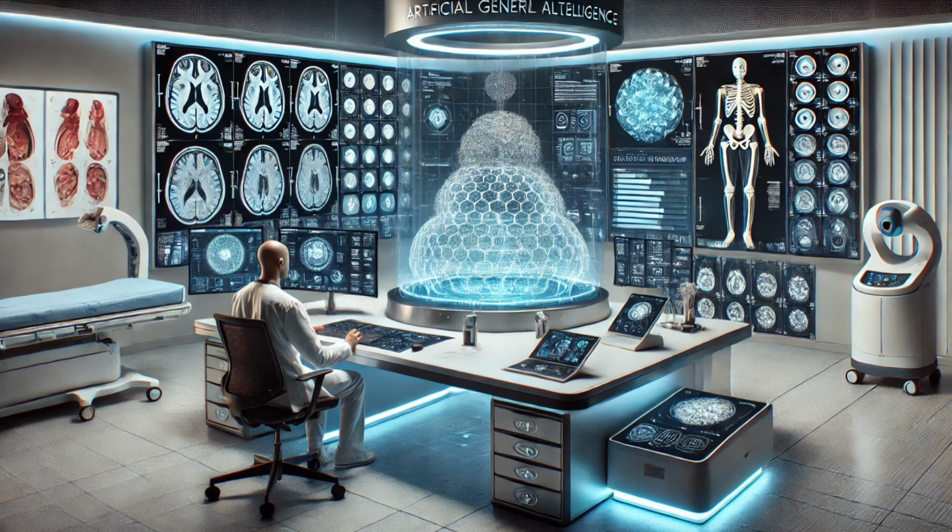Are there any examples where AI has already shown promise in this area? There's been some really encouraging research using AI to analyze mammograms. For breast cancer? Yeah, for early signs of breast cancer. And the AI algorithms have been able to detect subtle patterns that are linked to cancer. Exactly. Sometimes even outperforming human radiologists. Wow, that's incredible, but also a little unnerving. I know, it's amazing what AI can do.